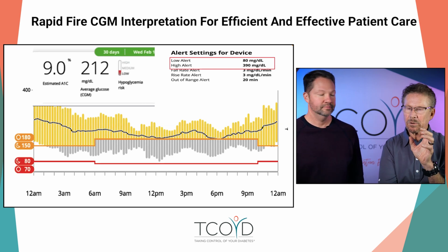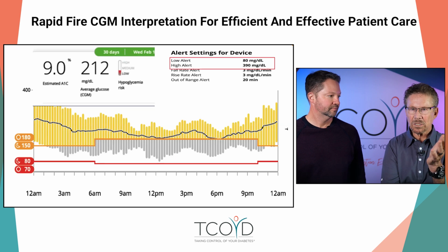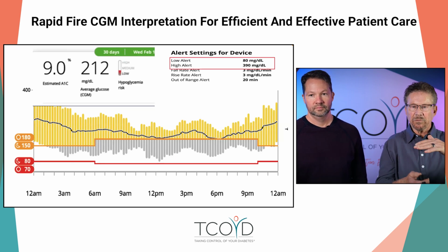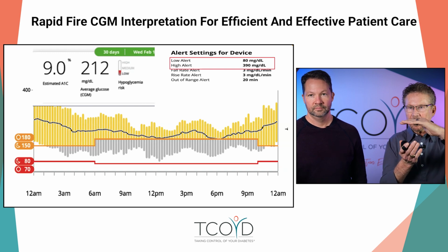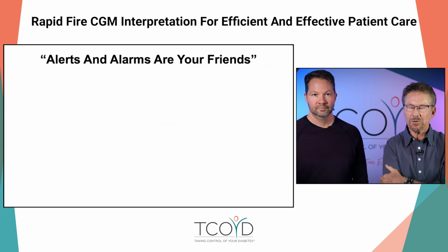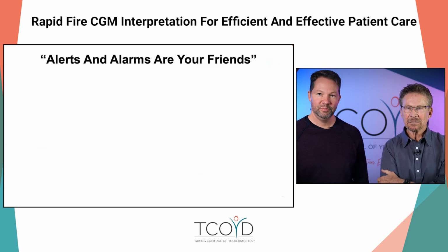And there is a topic called alarm fatigue, and we'll talk about that as we go through. So you've got to be smart and not give the patient a really tight range, and then it's going to go off all the time and drive them nuts, and then their partner wants to leave them. So give us your spiel on your alerts and alarms.